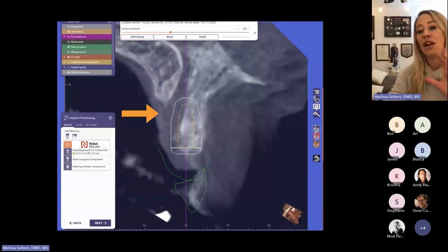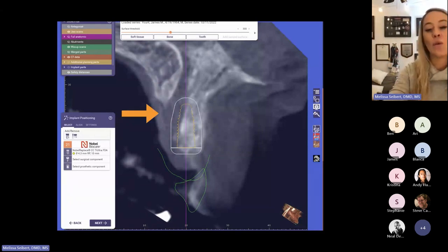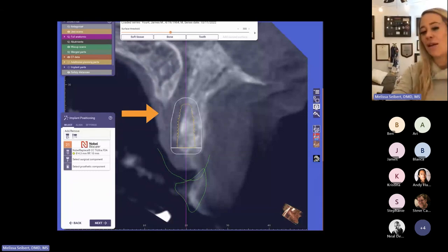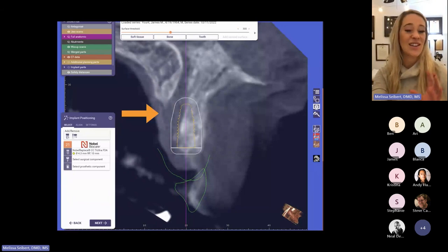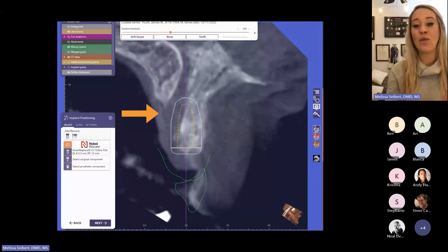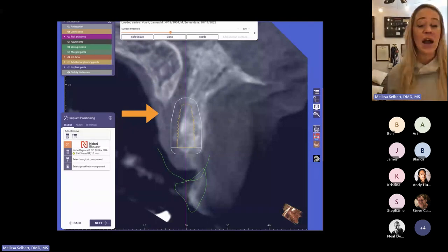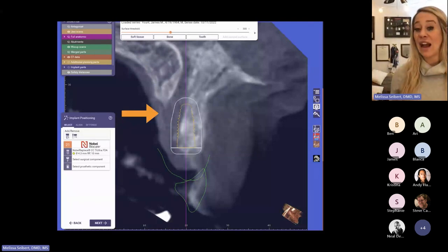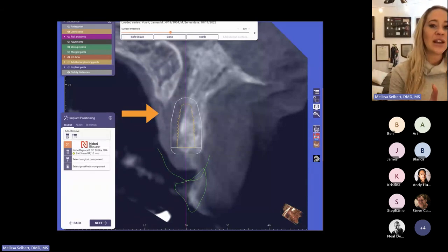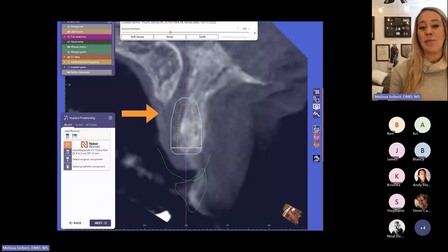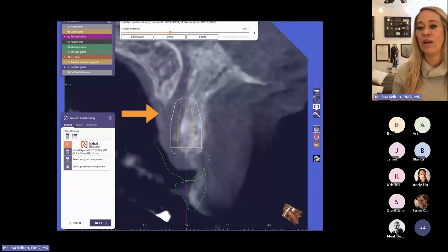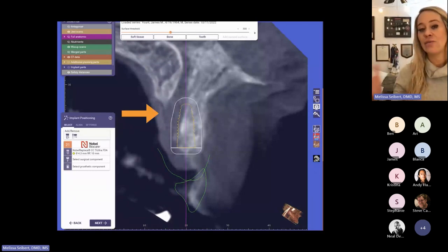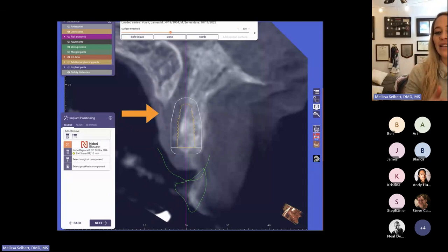Now I'm getting ready to place the implant in ExoPlan. What I also like about this is that virtually every implant on the market that exists is in ExoPlan, available for you to select, and it's constantly updating. Historically I've used Blue Sky Bio, which is actually pretty phenomenal and it's free, but you do have to pay to export the guides. With ExoPlan, you're paying the money up front, but then you're not paying to export the guides.